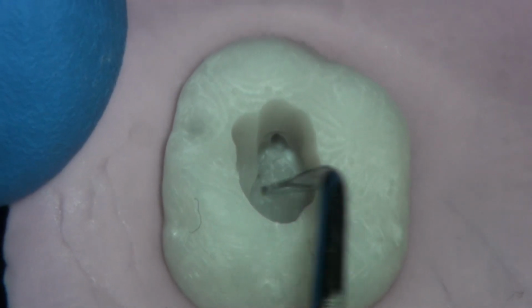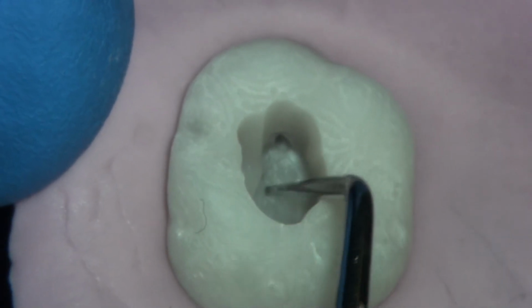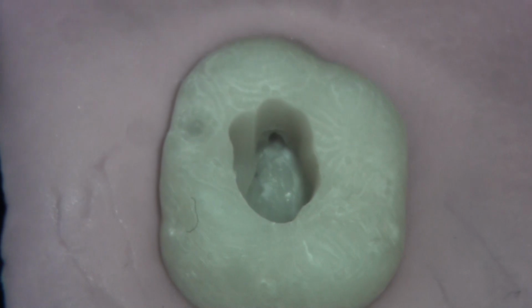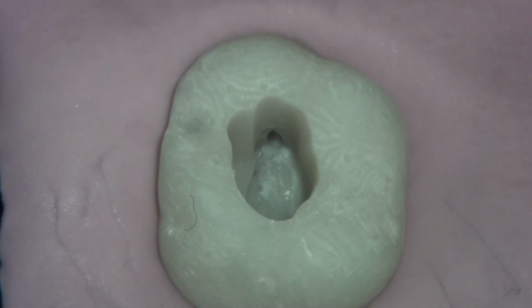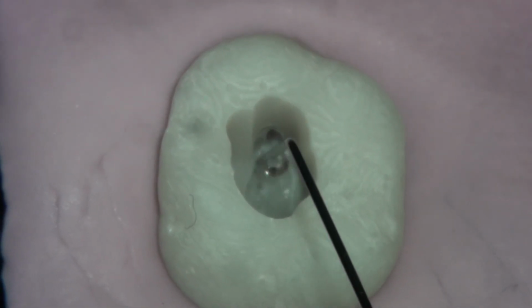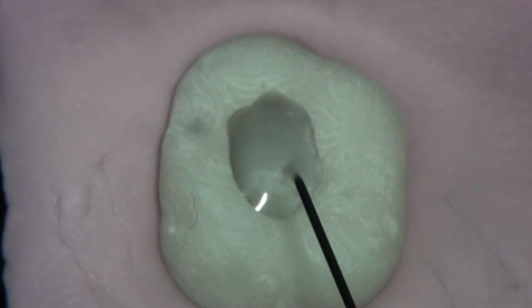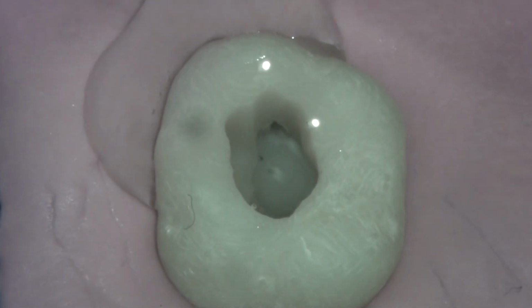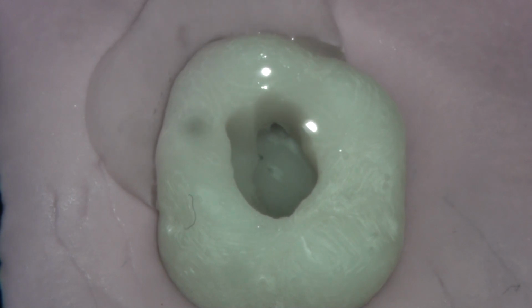We work our way back here, and you can see there's a catching point in our MB2, and you can see the action of the probe as it gets stuck, and we just pull it back out. And at this point we can identify where that MB2 orifice is. So as before with our glass block, we flood the cavity with some irrigant in order to ensure that we have lubrication for our file. And actually, interestingly, often the canal becomes a little bit more visible when you do that.